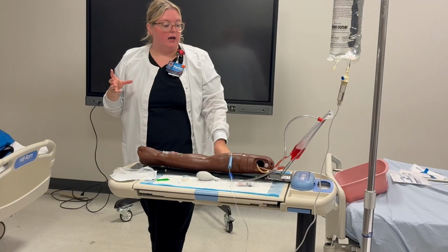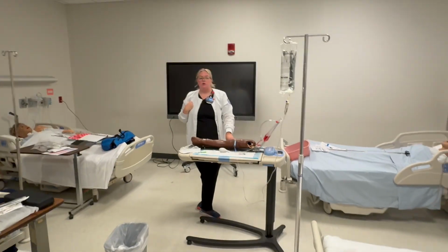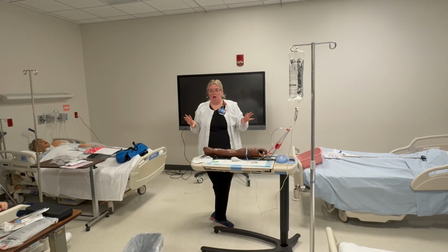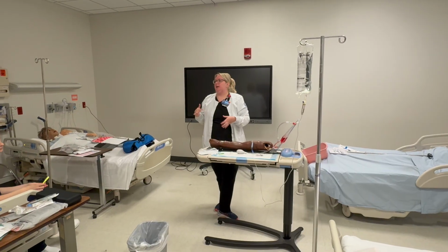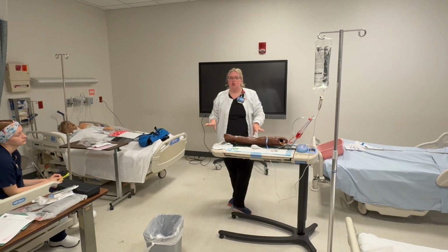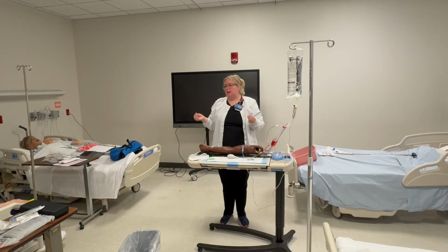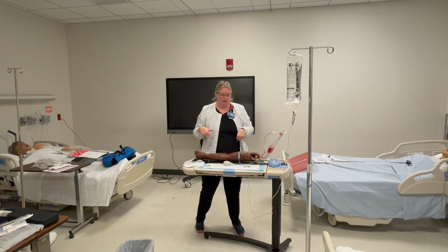So the doctor ordered this for 125 mLs per hour. We can't count what mLs are right now, so we would have to use math to convert that. Not making you do that for the checkoff, but in real life, we can work that out. We have a day that we practice some dosage, so we can work that out if you'd like. But don't worry about math for this checkoff, okay? All I want to know is that you know I have to look at drops to make sure that my patient is actually getting the medication that I say that I'm giving them. Does that make sense? Okay.